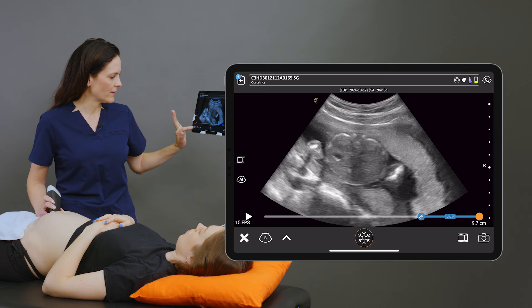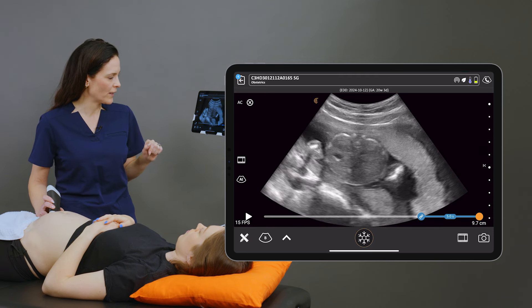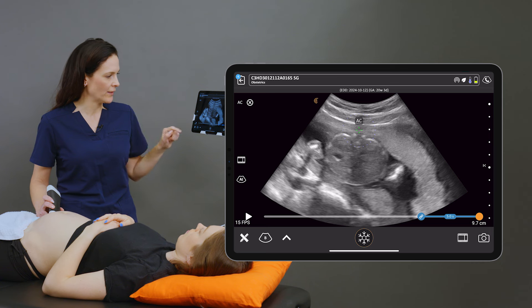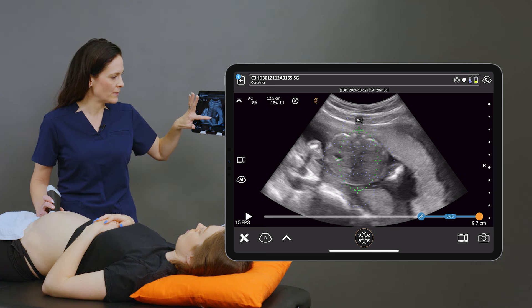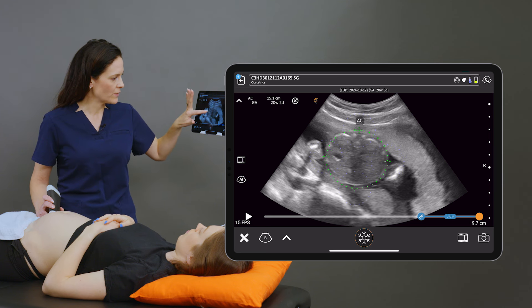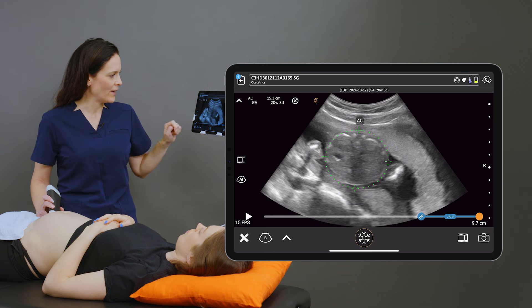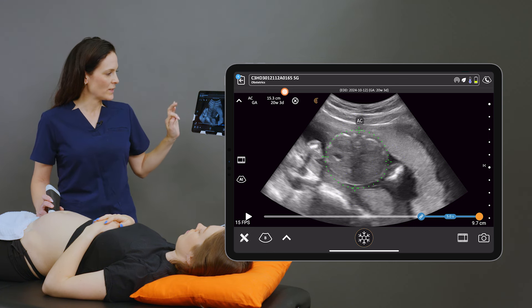I can select the measurement package under abdominal circumference, and I'm going to place a caliper posteriorly at the spine and anteriorly on the baby's abdomen. I can adjust the calipers as needed so that it goes right around the circumference of the baby, and here I'm getting 15.3 centimeters, which shows on the left part of the screen.